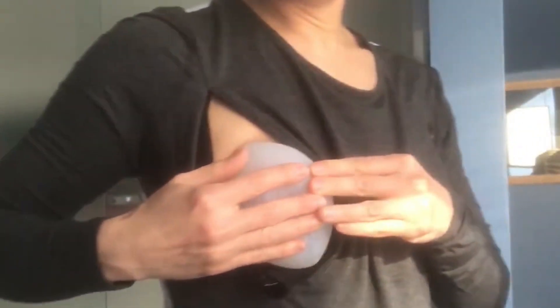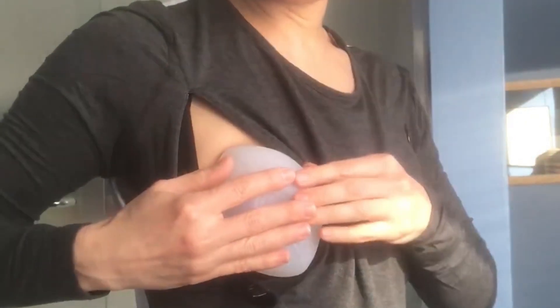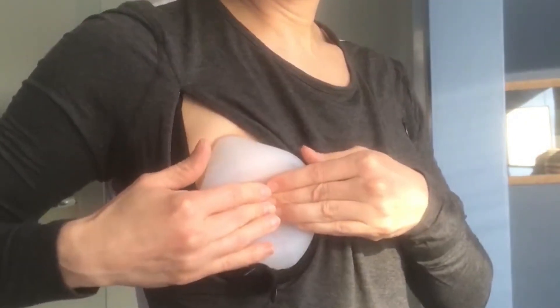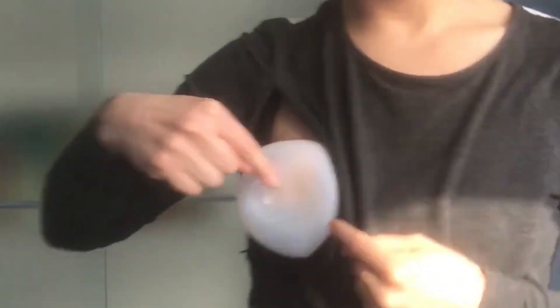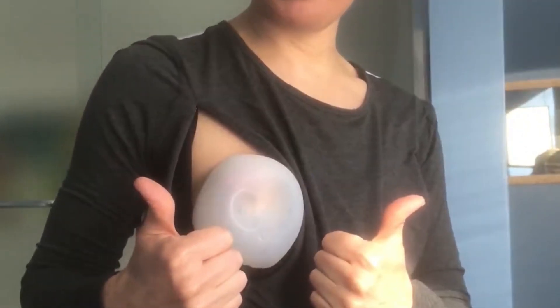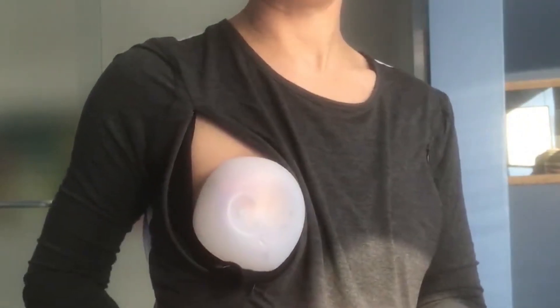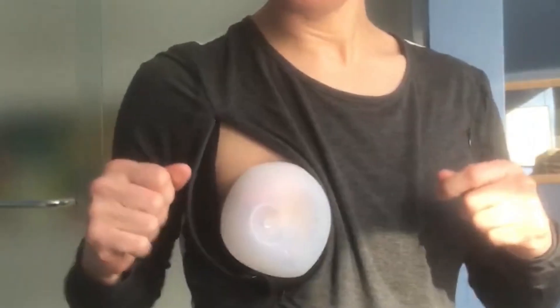Next, push the cup against your chest and listen for the sound. Notice how the shape of the cup stays deformed — that means that I have a good Kindest Cup Latch. The Kindest Cup Latch is gentle and secure and even works when you're lying down or jumping around.